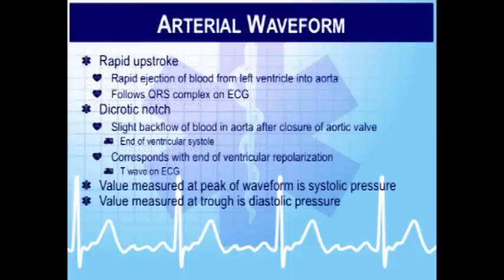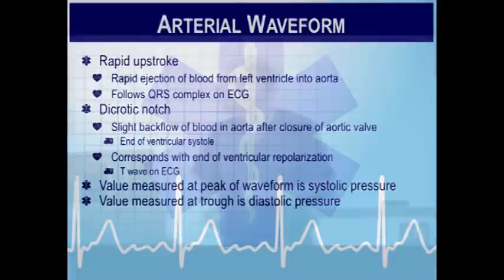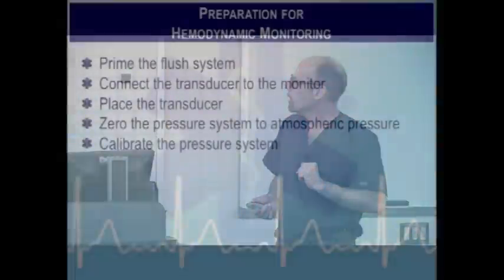How many of you have seen an arterial line and seen an arterial waveform? So not new information for you. I sort of talked about all these things already, a 500 cc bag of saline or heparinized saline.